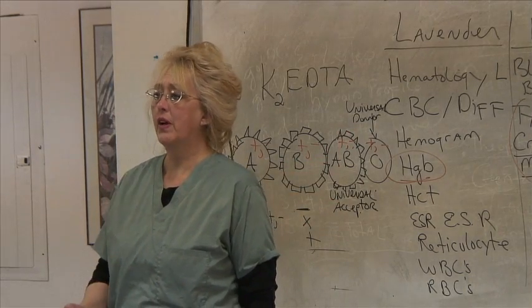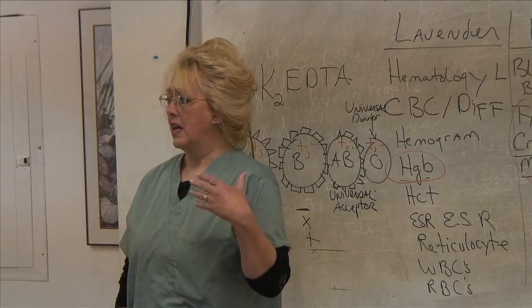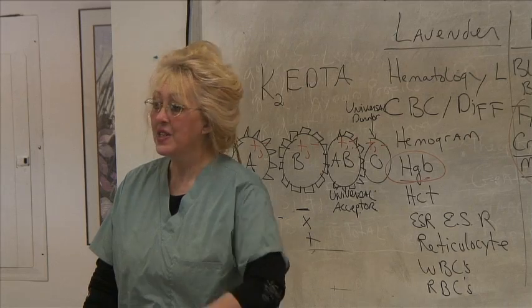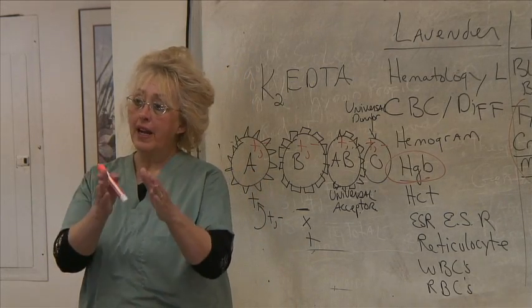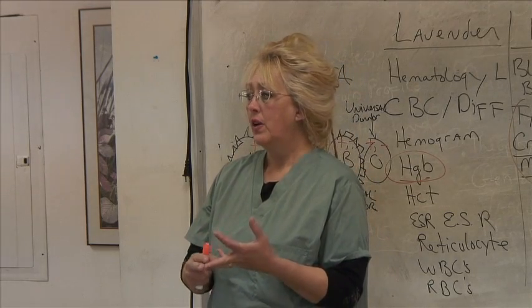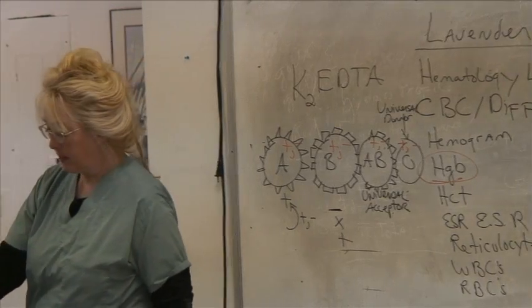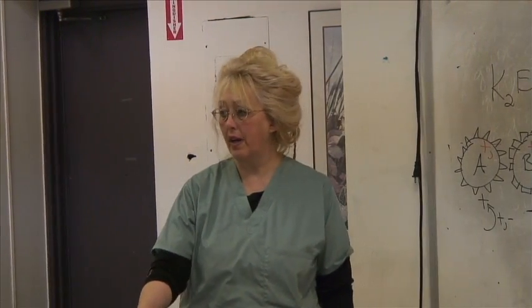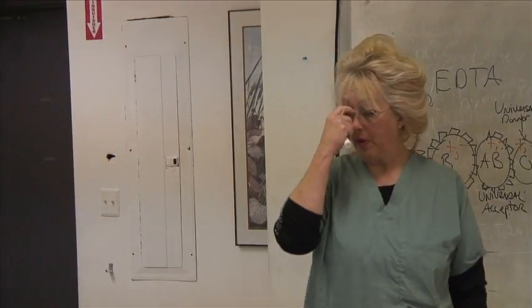But somebody with congestive heart failure, somebody whose cardiovascular system is compromised, and let's say we need to give them red blood cells, we may just give them packed cells as opposed to giving them the whole blood because we don't want to overload them with too much fluid. So we can break the blood up into plasma, into fresh frozen packed cells, into whole blood. Blood can be divided up, as you saw yesterday in the serum separator tube, Miss Sonia's blood, right? You saw what the serum looked like, right? You saw how the formed elements separated from the serum, which, of course, if we had the lithium heparin, it would have given us the plasma.